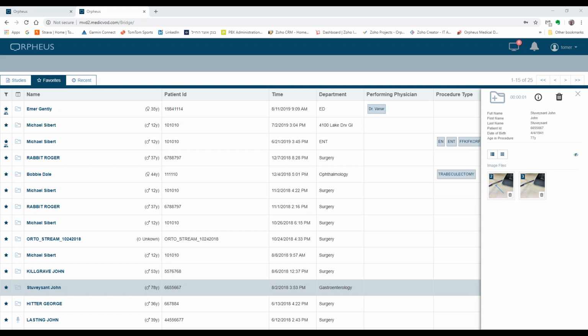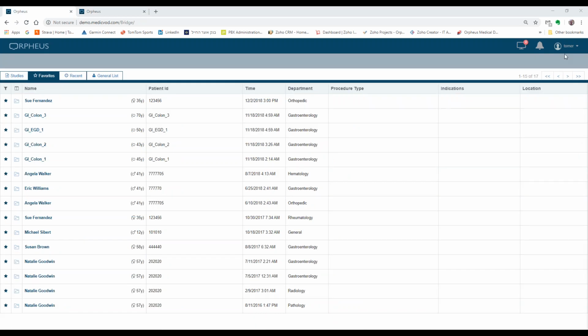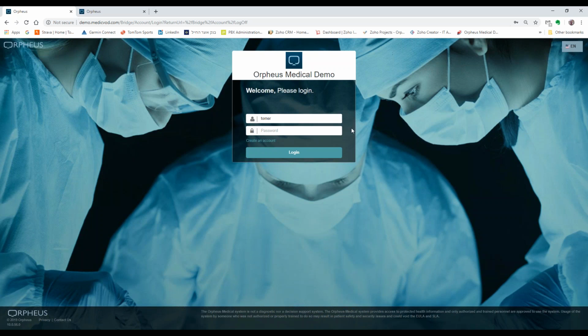So we've created a couple of user groups already, and probably most of you already have logged in at least once into the Alberta system. The two main groups that we're talking about, of course, are the admins that have elevated permissions, as well as physicians that have less so. The idea, of course, is that everybody logs in with their LDAP or Active Directory login. Why don't we show really from the basics what we're talking about?